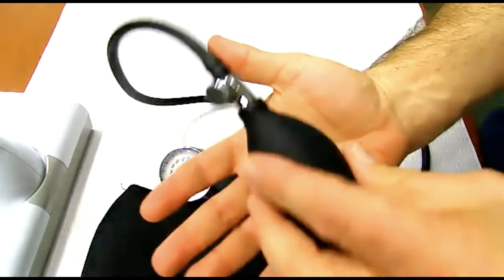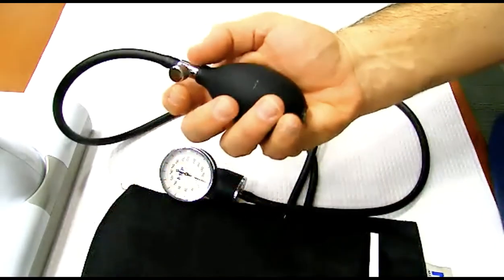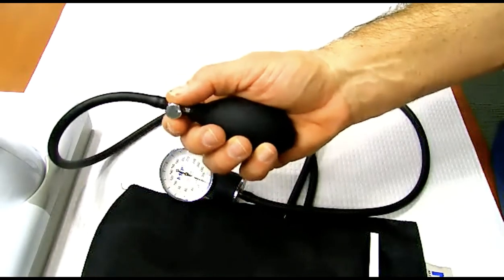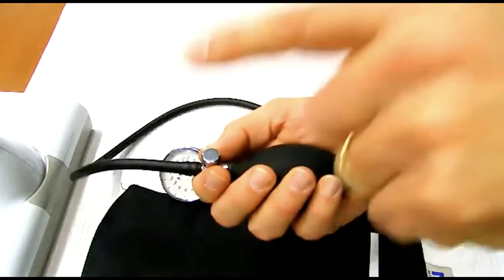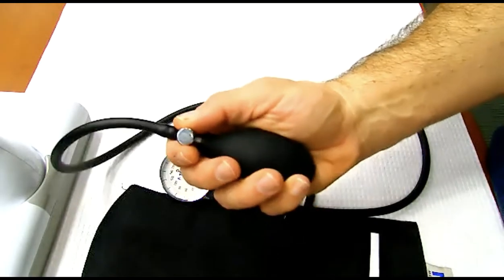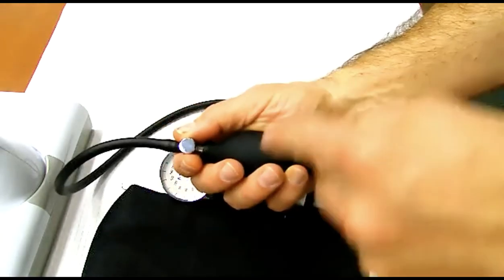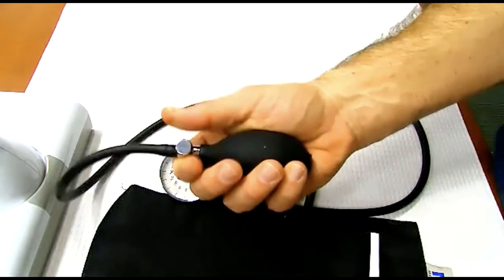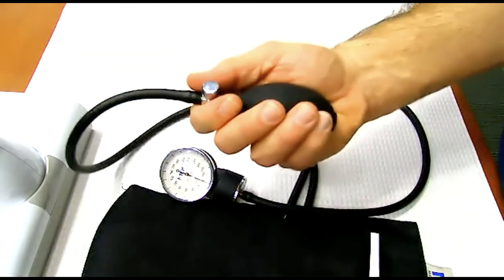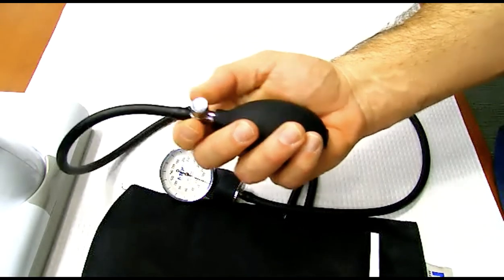The best way to hold it is to open up your hand and put the bulb valve comfortably in the palm of your hand. Wrap your hand around, and your index finger and thumb should be right across from this roller valve. Hold it so that you're looking straight down on the roller valve, between your thumb and your index finger like this. Now, roll it clockwise, to the right, until it stops. That locks it. So now all the air I put into the cuff stays in the cuff. To let the air out, I have to turn the roller valve counterclockwise.